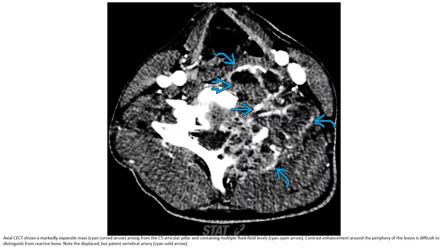On contrast CT, there is a remarkably expansile mass arising from the C5 articular pillar and containing multiple fluid levels. Contrast enhancement is seen around the periphery of the lesion. It is difficult to distinguish from reactive bone changes. Note the displaced but patent vertebral artery.